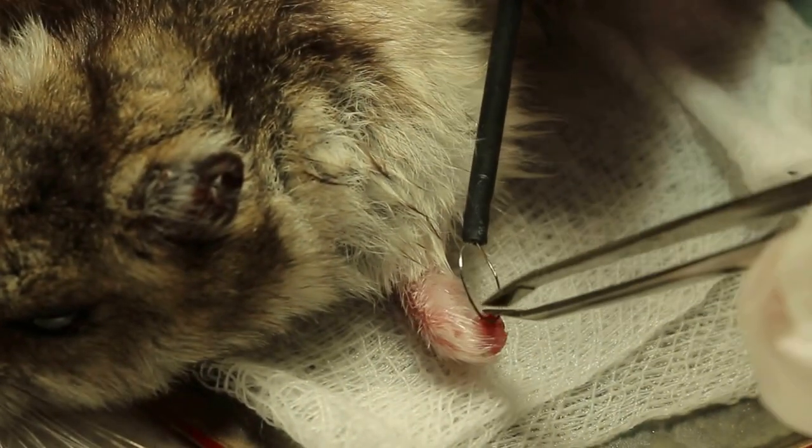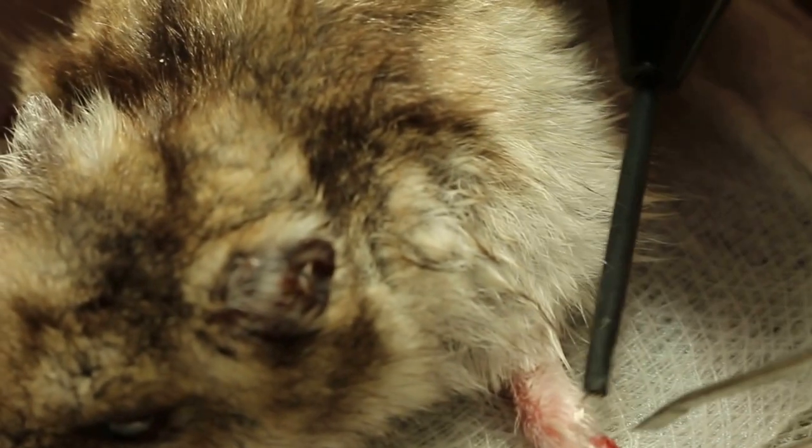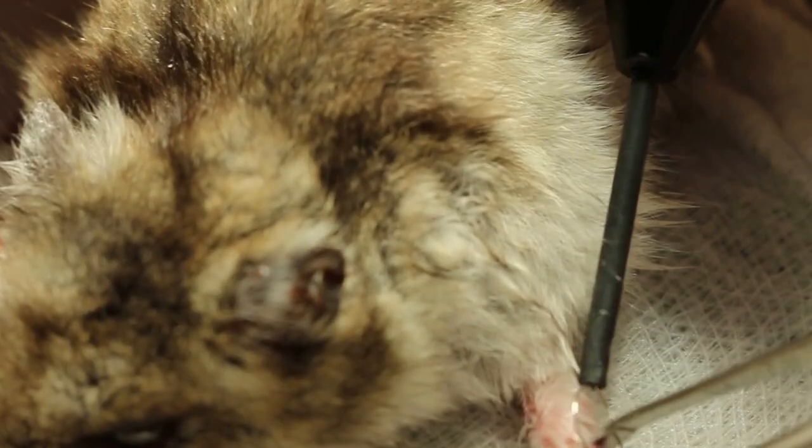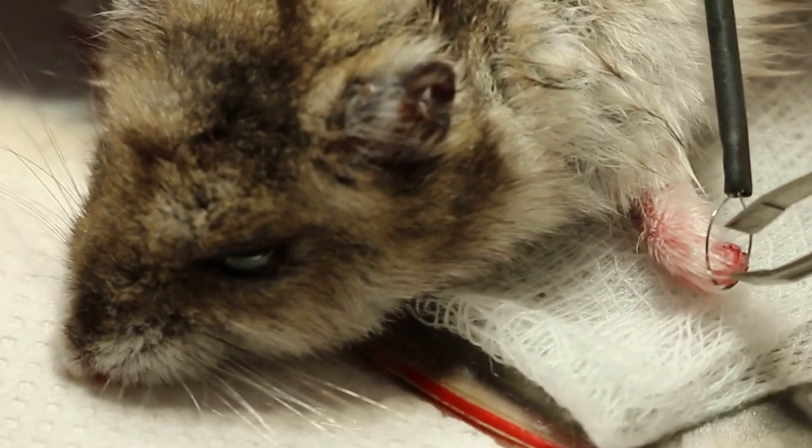Okay, now I'm going to just burn off the wart with the loop. Okay, so you can see I put the loop through. I look through the wart. You can see from your side. No, but be very careful. I have to be very careful because of the leg, the toes.